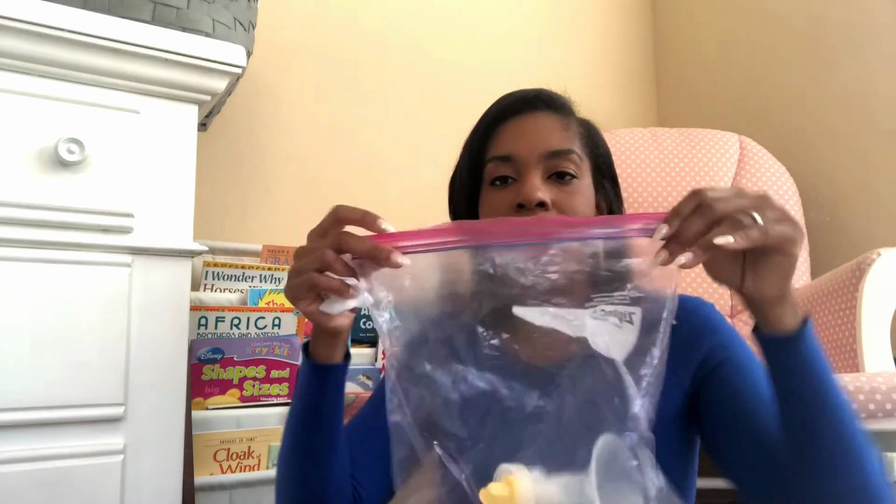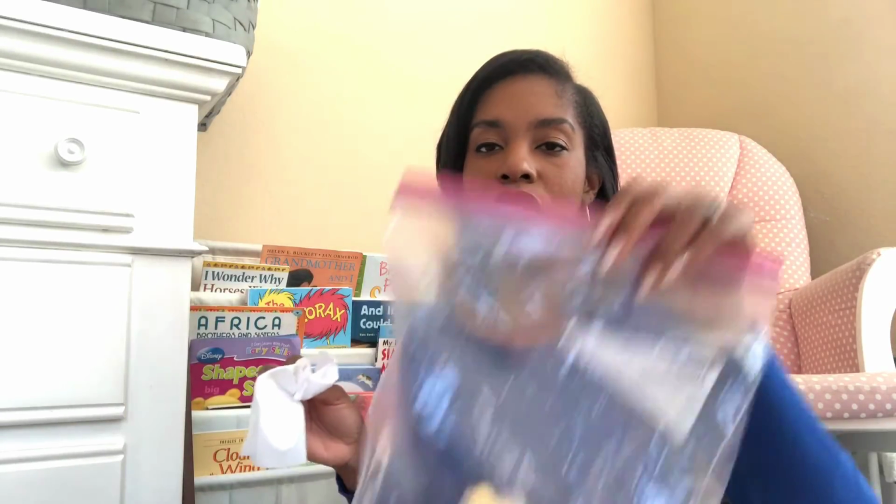It worked for me. So I would take one of these and I would just wipe it down like this. And I would take the yellow part out. This is not called the membrane, but it's part of it. The white part, I believe, is the membrane. And all the names are online when you order the pieces. So I would do it like this and then throw it in the bag. Most likely I would pump one more time, and so I would have to rinse it out, but normally I would do that at the very last break that I knew that I wouldn't be needing this again.